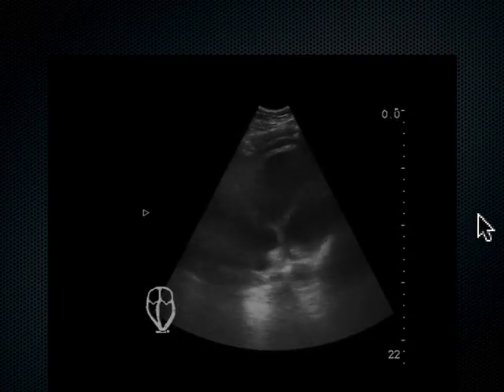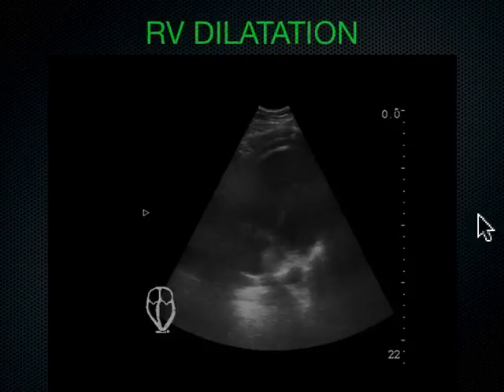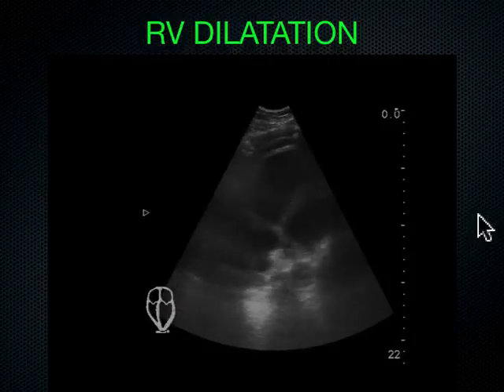So in this clinical setting of an external fixator on this young guy who's in cardiac arrest with a large RV, we pushed thrombolytics, and 2 hours later, the patient was upstairs in the ICU, extubated, eating dinner. An employee of the hospital, so it was made a big deal and all that stuff.